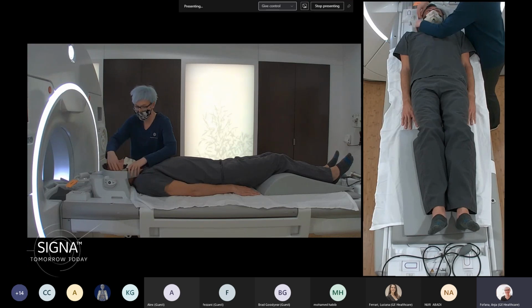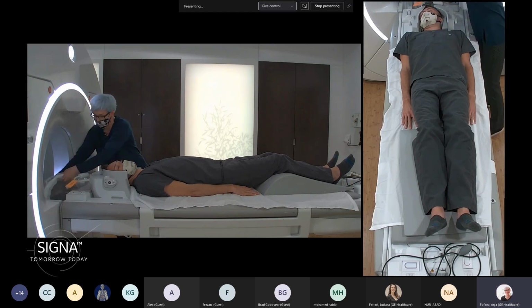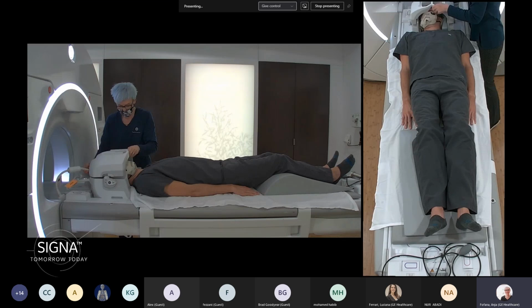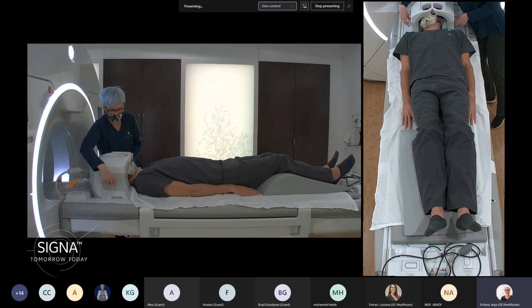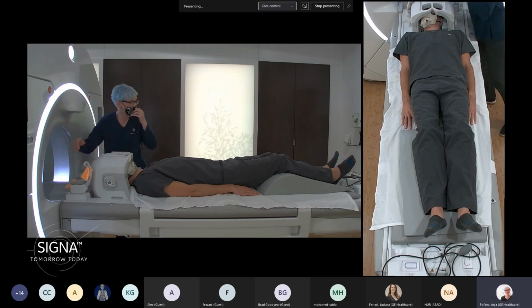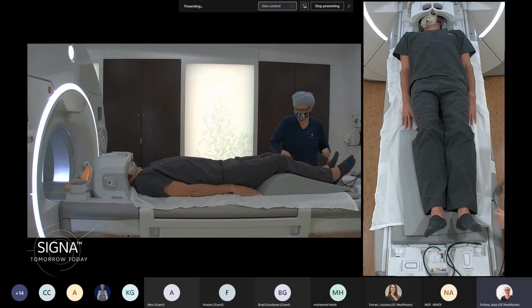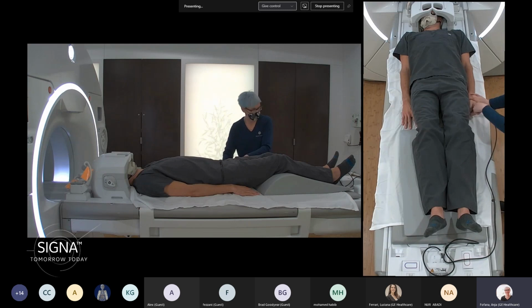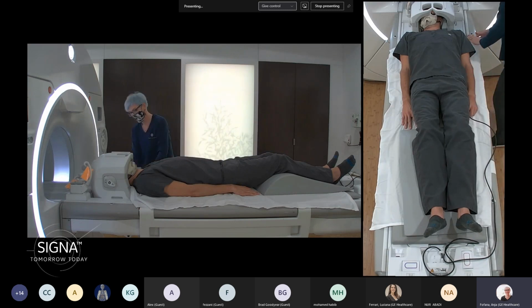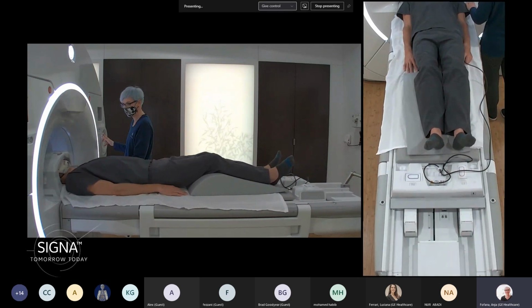And now maybe you can rotate a little bit your head because we want to start looking at your brain in a rotated environment, and then after the first sequence, I will put it straight. Everything comfortable? Awesome. Here's the squeeze bar in your left hand, and then we just landmark with the IntelliTouch, and you just go straight in for your first step.